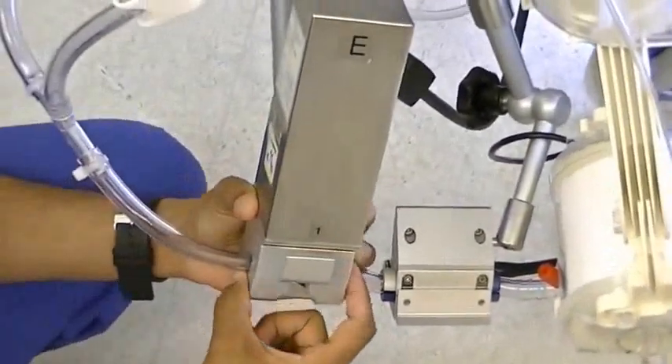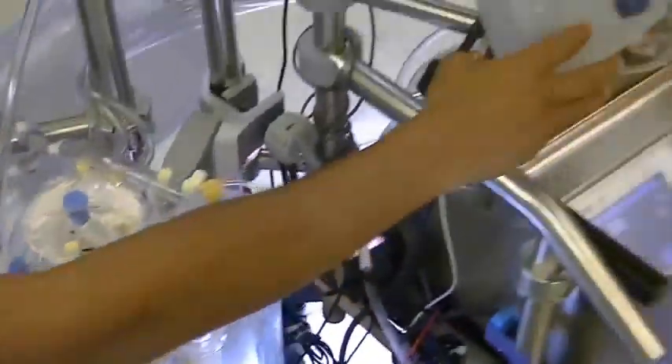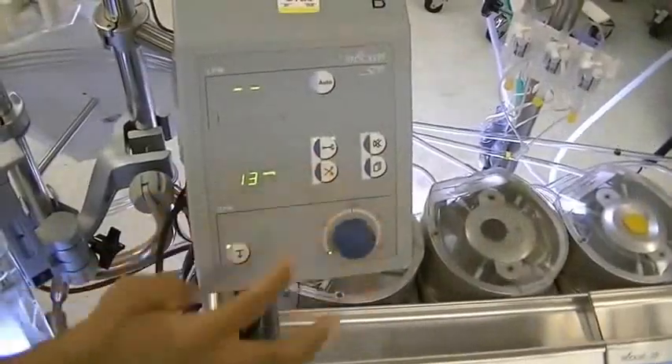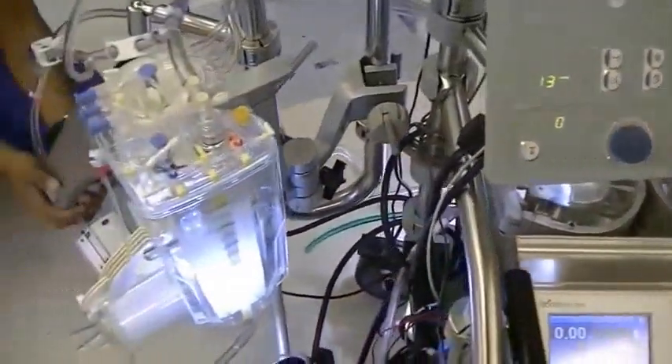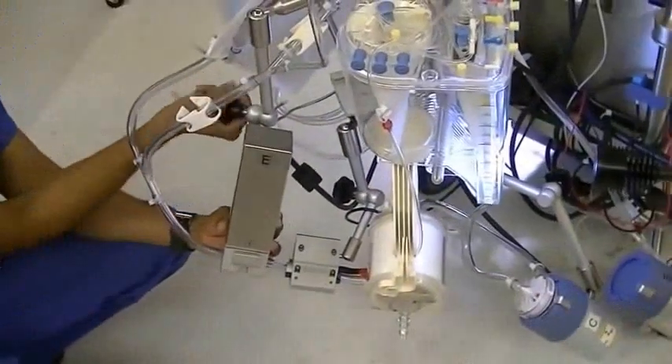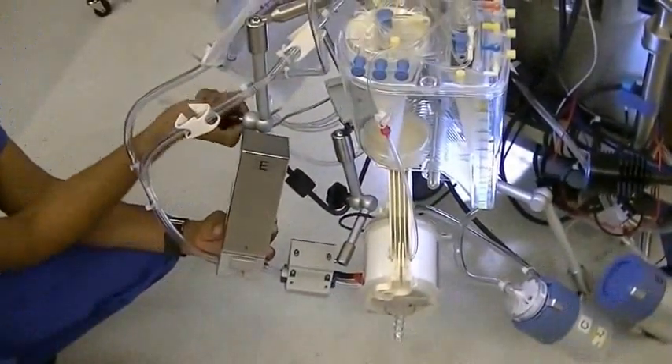If the E-clamp is engaged, you can always disengage the E-clamp by manually opening it, closing it or opening it. Once that is set in place, you can tighten it and lock it in.